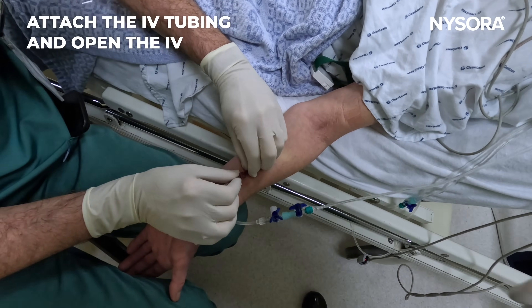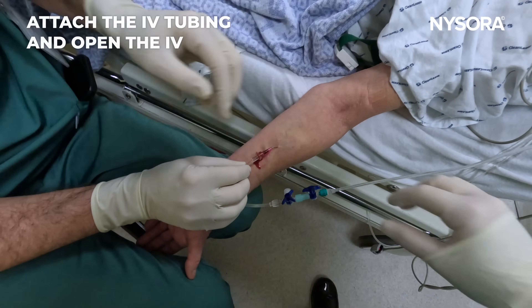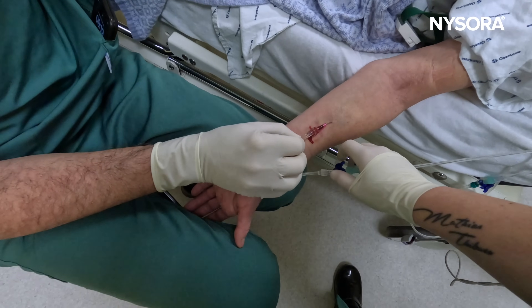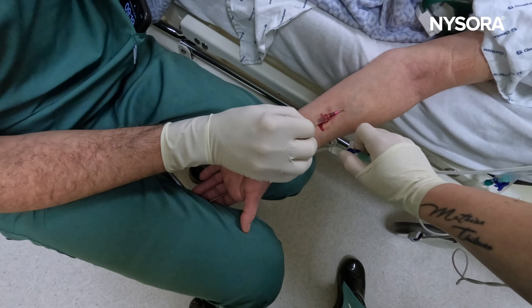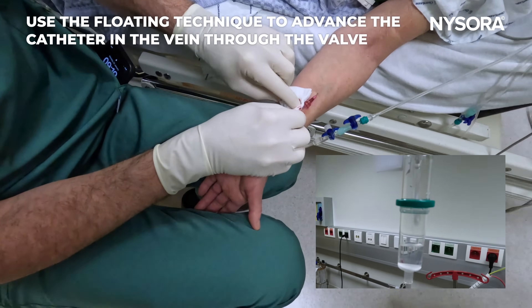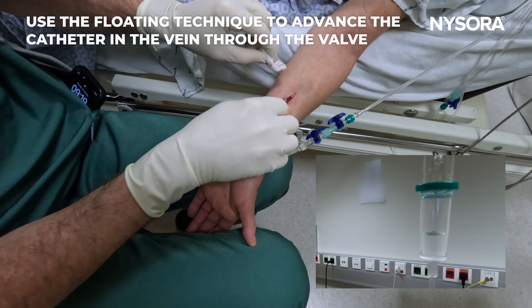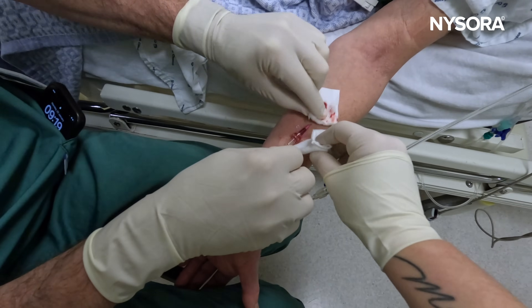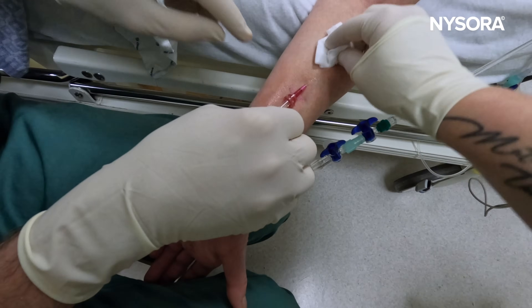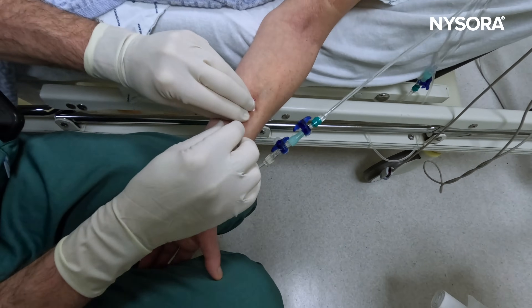We're sufficiently deep. Now we're going to open the IV and see if, once we initiate the flow, we can actually feed it further. Okay, that's great — there we go.